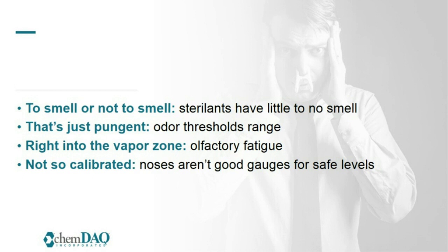The bottom line is that our noses have not been calibrated to determine whether a liquid chemical sterilant is below or above the parts per million threshold for safe practice. The only way that we can accurately determine the safe level of liquid and chemical sterilants is through the use of continuous monitoring devices. And I want to take a short break here and ask you a question.